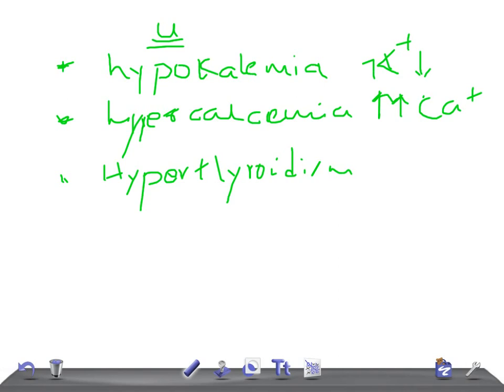For hypercalcemia, you see prominent U-waves along with the most important characteristic: shortening of the QT interval. If you see prominent U-waves with shortening of the QT interval, check the blood calcium level.